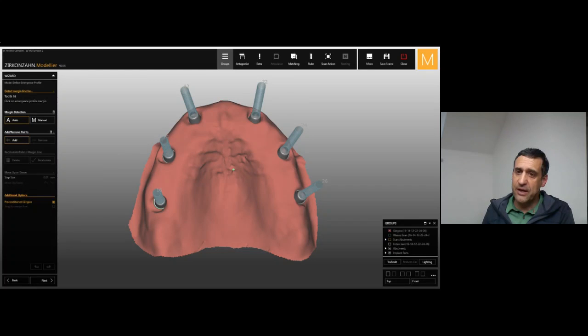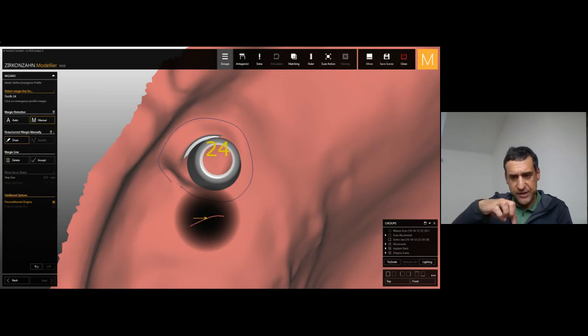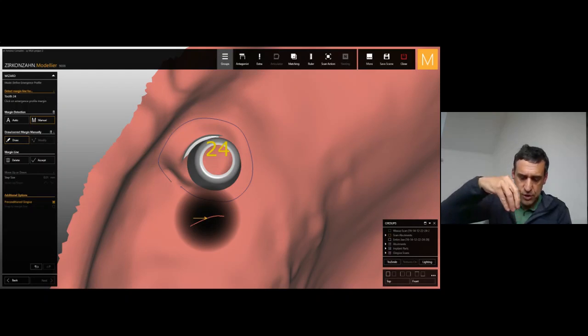You can see that here I was also selecting sealing. You remember that I talked about the possibility of having the sealing thread inside the framework. The software shows you this sealing directly, and you can screw in this thread once it's milled. It's really easy to fix the real screw because it stops directly on the head of the real screw, and the whole channel screw is sealed really accurately.